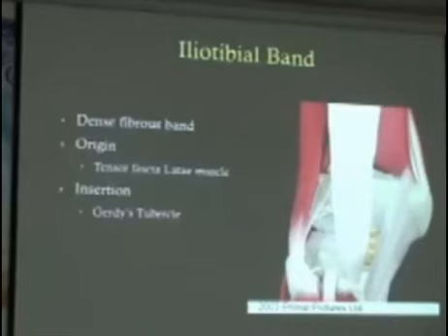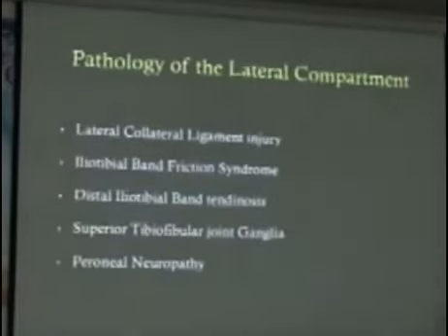And why this becomes important is that with knee flexion and extension, this iliotibial band actually flips across the lateral condyle of the femur. And because of that arrangement, this is a very common site for a frictional band pathology.